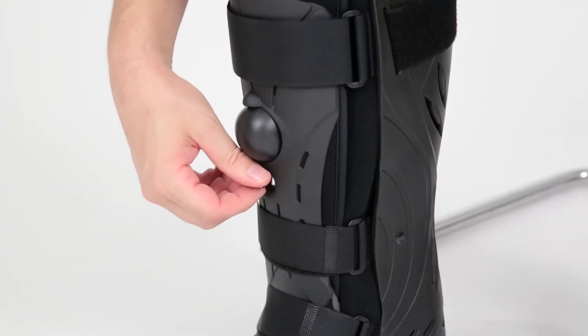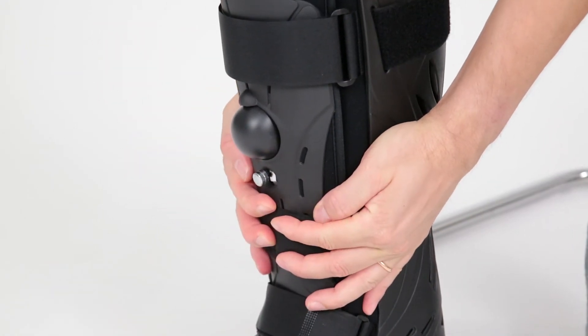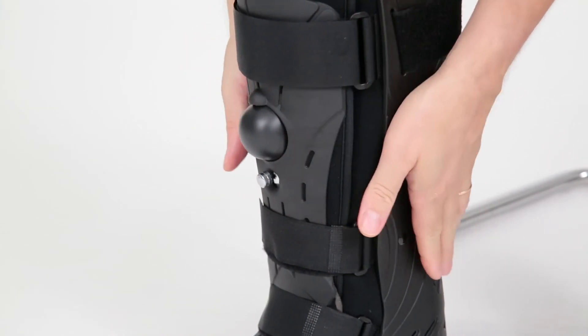Set the air valve to deflate by turning counter-clockwise. Use hand compression to speed up the deflating process.